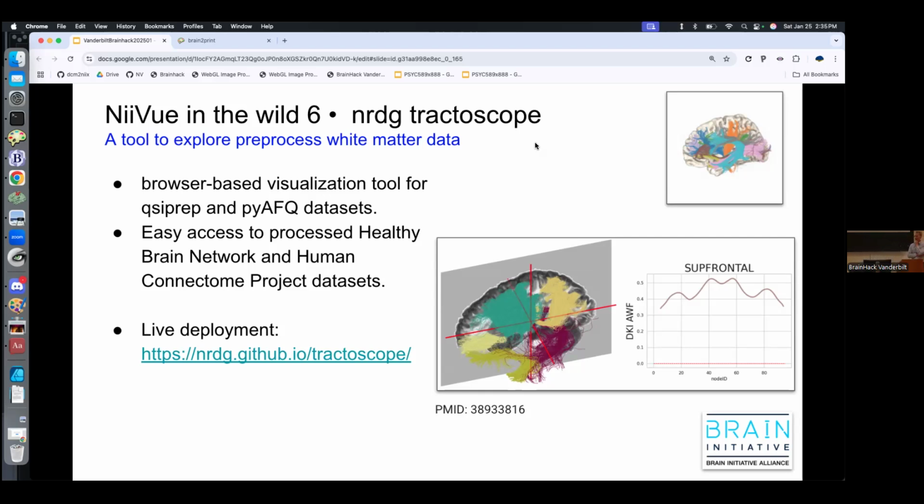It's coming along. So the Nilearn team is very keen on this because right now they have 3 different independent rendering engines that they aren't really happy with either. And so they have some Chan Zuckerberg funds to support this. And then Christian O'Reilly and our team is working to meet them. And so I think it's happening very rapidly now. We had to get to the right state of having everything else stable. And it's now coming together very quickly.